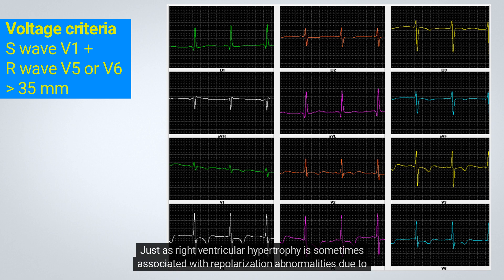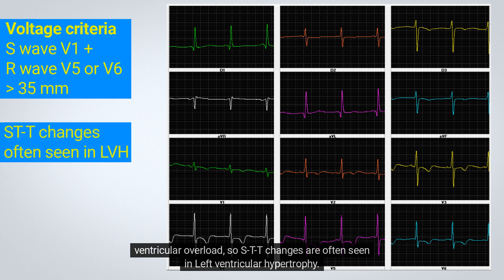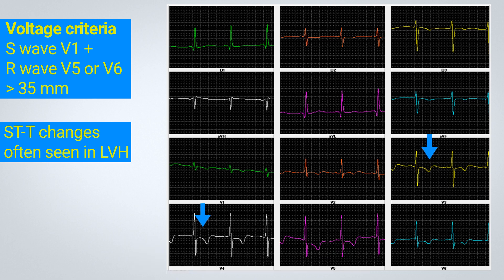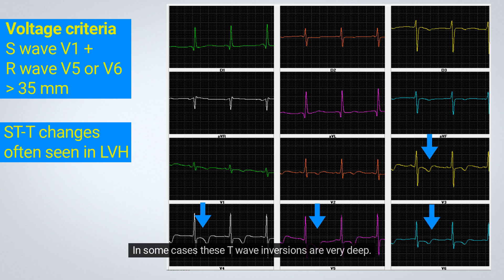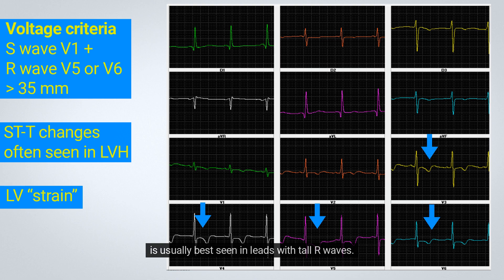Just as right ventricular hypertrophy is sometimes associated with repolarization abnormalities due to ventricular overload, ST-T changes are often seen in left ventricular hypertrophy. The complex usually has a distinctively asymmetrical appearance, with a slight ST-segment depression followed by a broadly inverted T-wave. In some cases, these T-wave inversions are very deep. This left ventricular overload-related repolarization abnormality, formerly called left ventricular strain, is usually best seen in leads with tall R-waves.